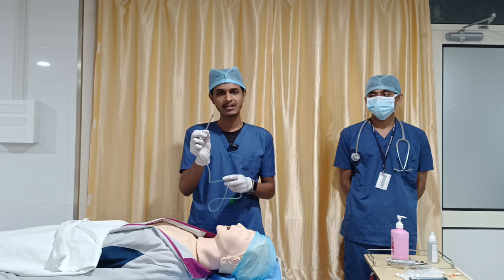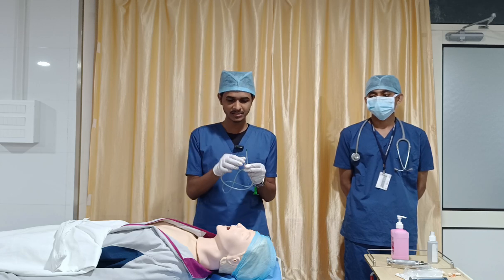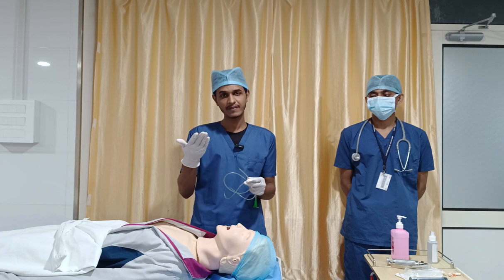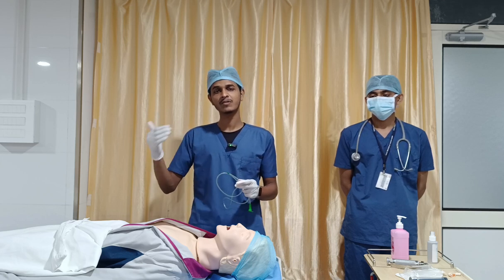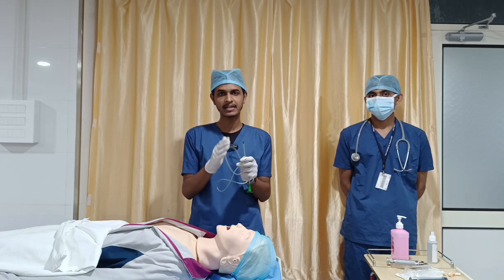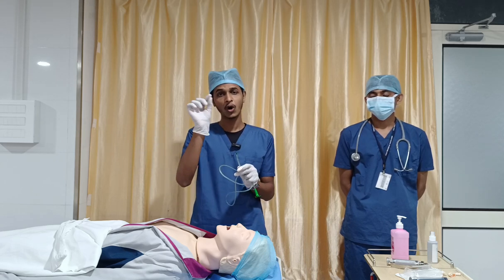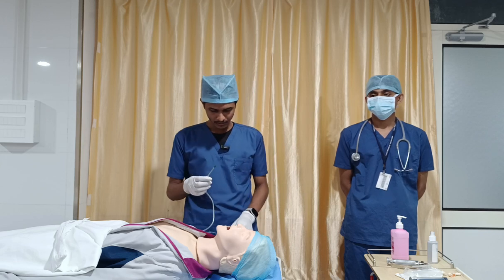So the catheter also, if you are going only for the purpose of feeding, you can choose the 12 French, that is more than enough. If you want to decompress the stomach or perform lavage, then 14 or 16 French is the ideal one. There you will get a larger diameter lumen. So these are some common things you have to remember.